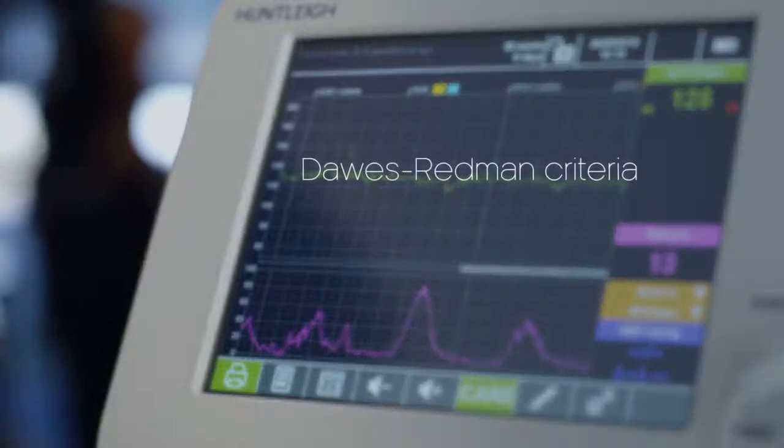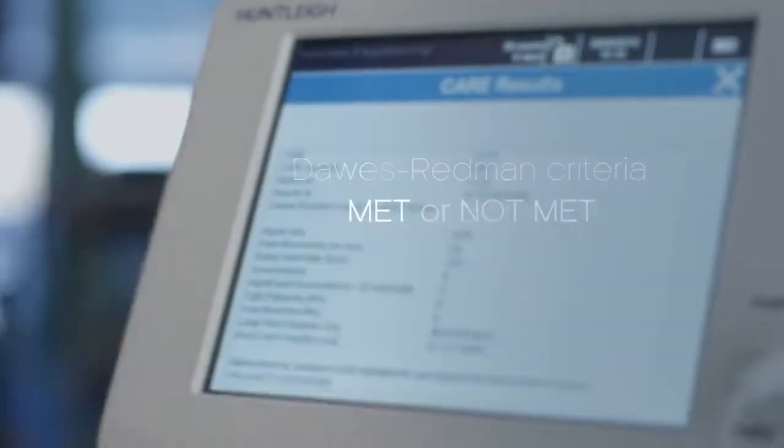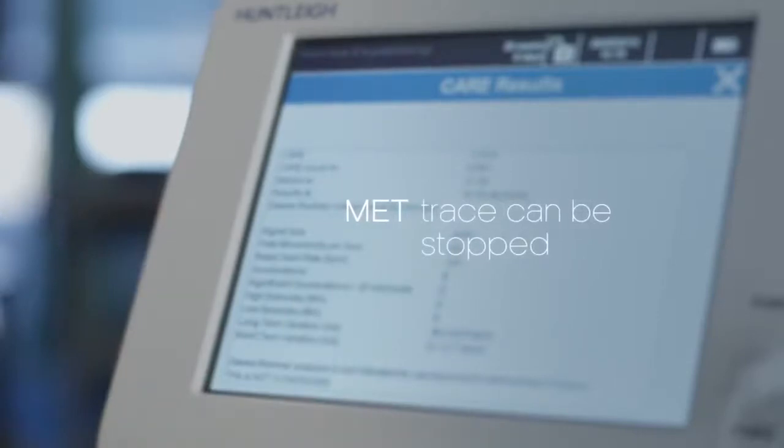It's reported as DawesRedman criteria met or not met. The advantage of when it's met is that the trace can be stopped at that point. It's a massive time saver.